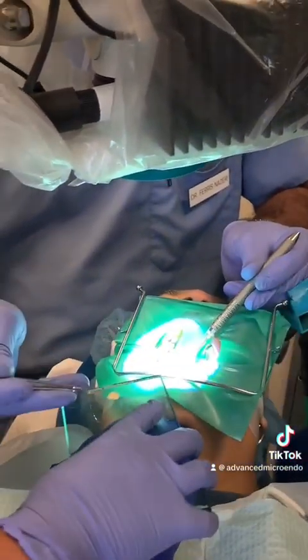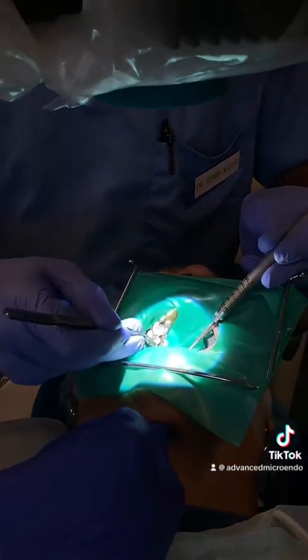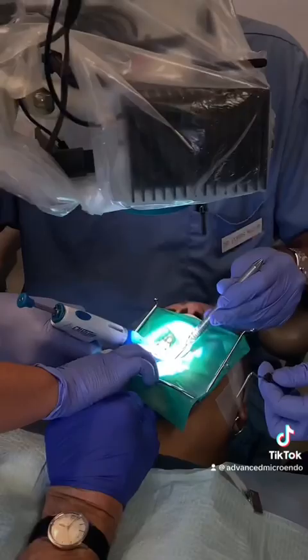I'm just gonna leave the GP in there. And then I'm gonna leave it.